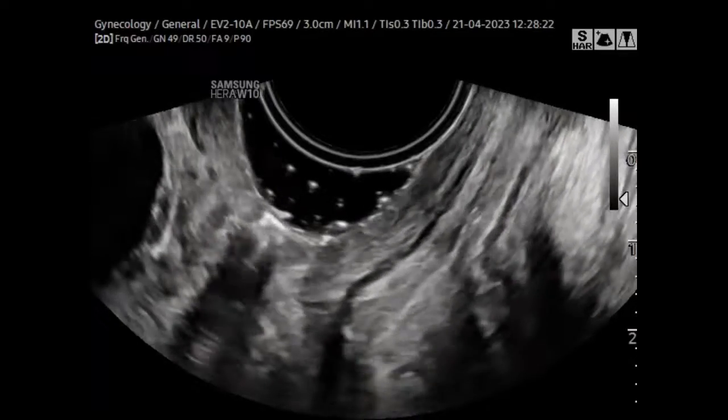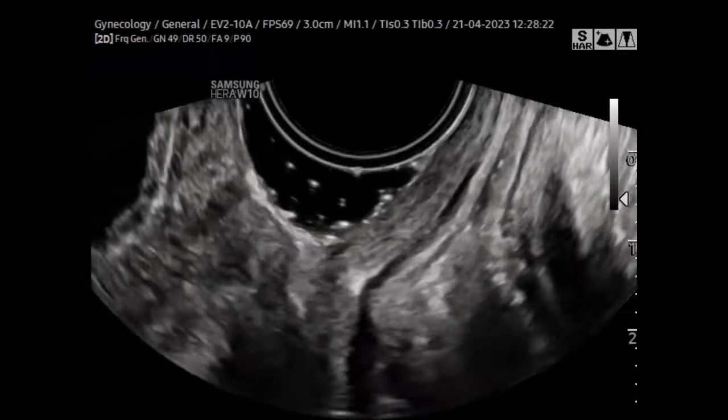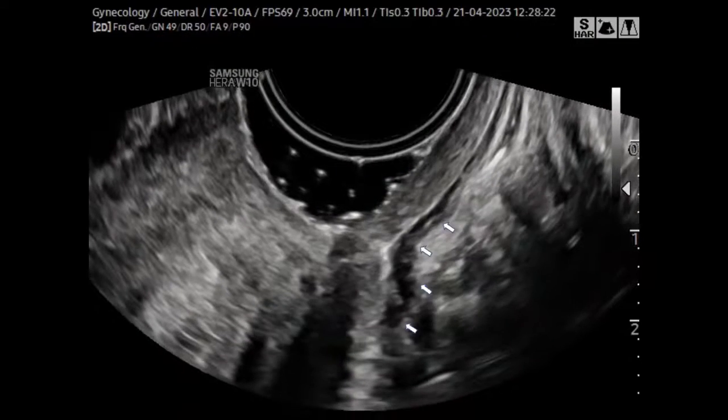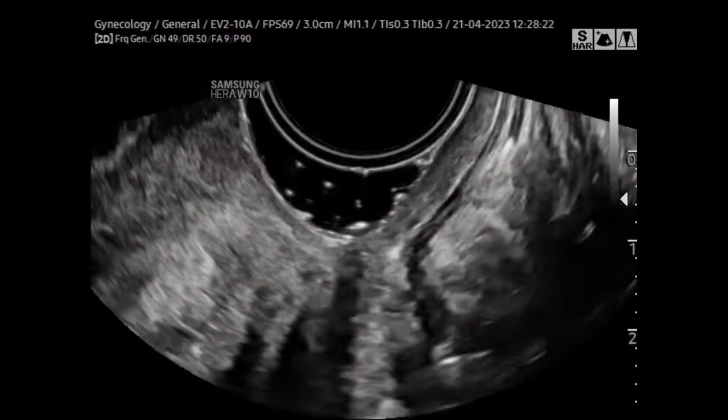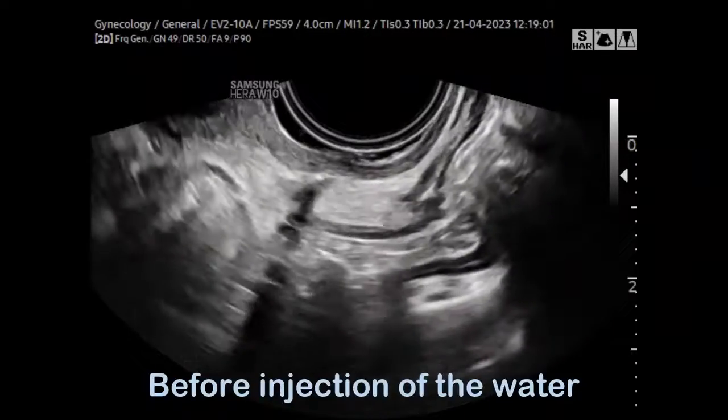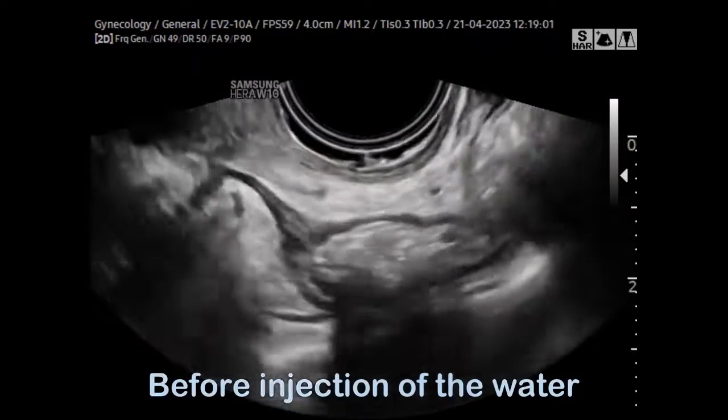Just as for the previous technique, it is important to slowly introduce our probe. Following the rectal windings, try to notice if there are any signs of thickening of the rectal wall or extreme folds while scanning through. This is another case in which you see nicely the different layers of the rectum.